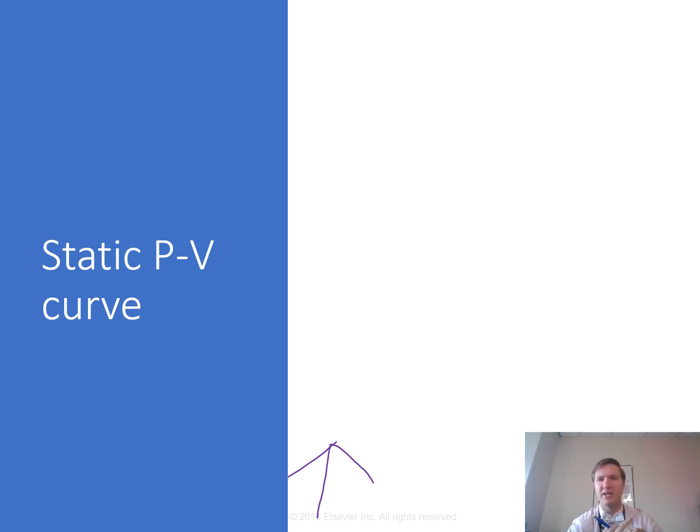During procedures for obtaining a PV curve, the patient is typically heavily sedated. Sometimes they'll use a short-acting paralytic on these patients, and make sure the ventilator has the appropriate software to get these measurements. They can also use a 1 to 3 liter super syringe attached to the ET tube, so precise volumes are pushed into the lung. They're held for about 2 seconds, long enough to allow the measurement of plateau pressure. The pressure is then measured at each delivered volume. It's kind of a cool thing, but that is one way of doing it.